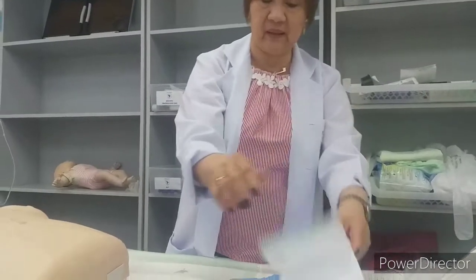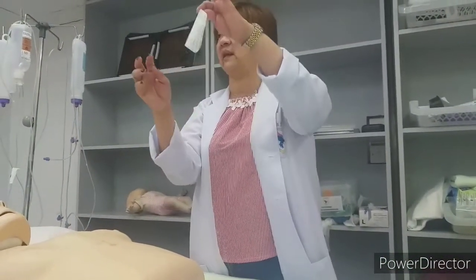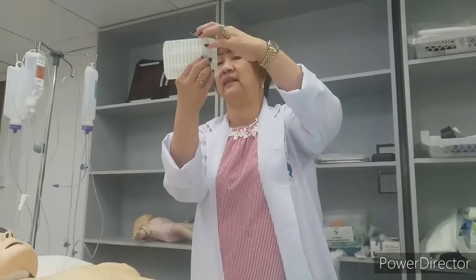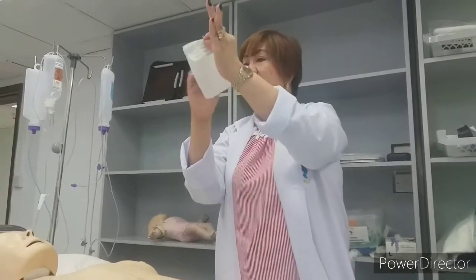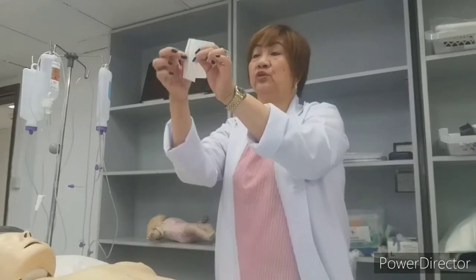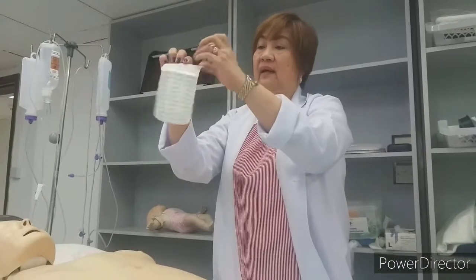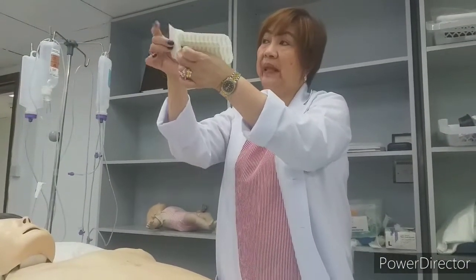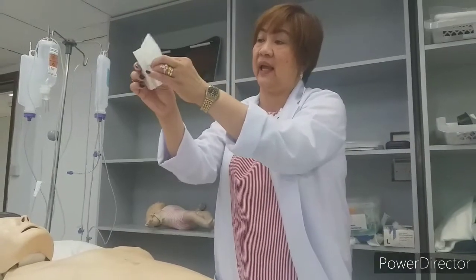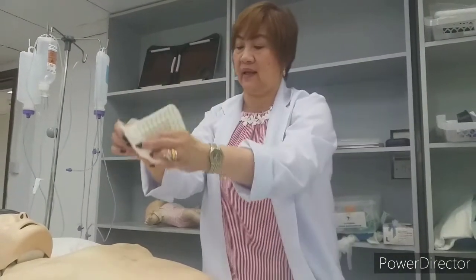Okay, in the middle, put this here. You will find here, just like the bigger version of your Band-Aid, you have the smaller side. To the left, smaller side. You do not hold anything from in because that is sterile. So the smaller side will be on your right.